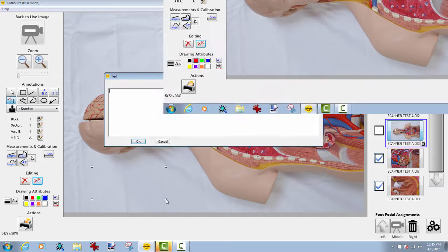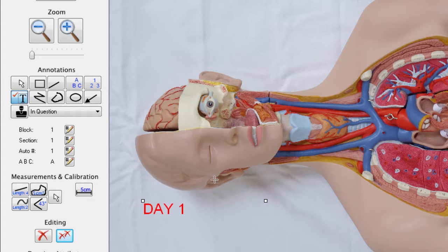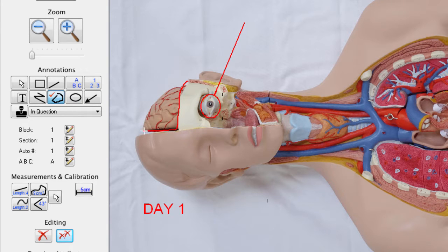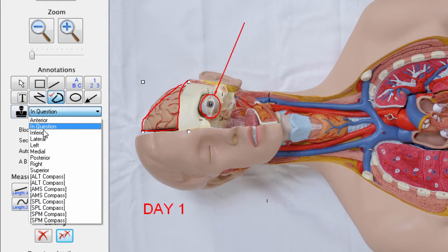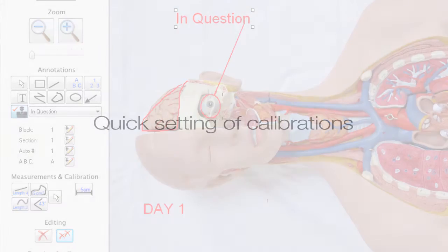PathSuite software provides you with a full selection of annotation tools to add text, arrows, shapes, and freehand drawing to your images. The powerful text stamp tool allows you to store frequently used words or phrases in a drop-down list to quickly add them to your images as well.